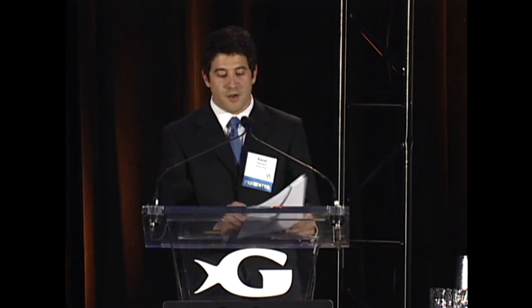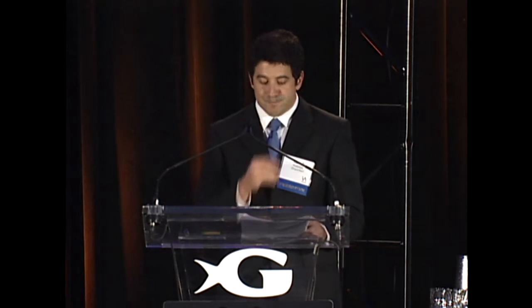This and other inconsistencies with the silicone impression process have led to a perceived low quality in the hearing aid industry. And luckily, we found a better way to do this, and that is by doing a direct in-the-ear 3D scan. For the patient, it's like an otoscope examination. If you've been to the doctor and they look in your ear, that device is an otoscope. So the process for the patient is very similar to that.